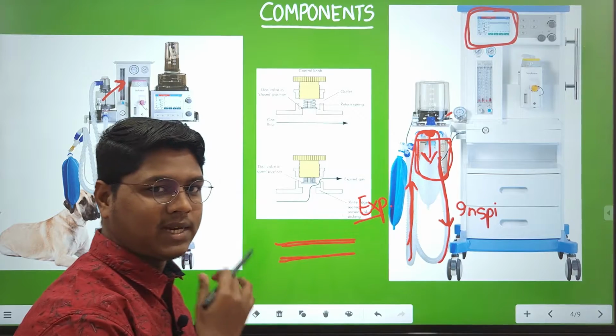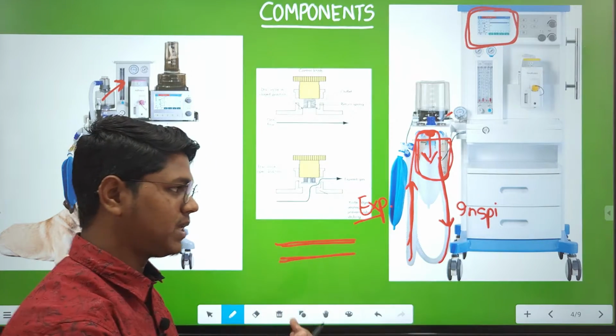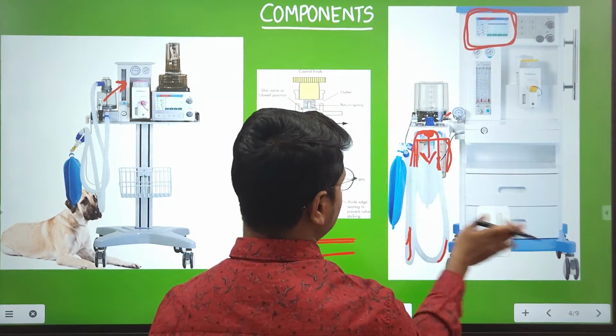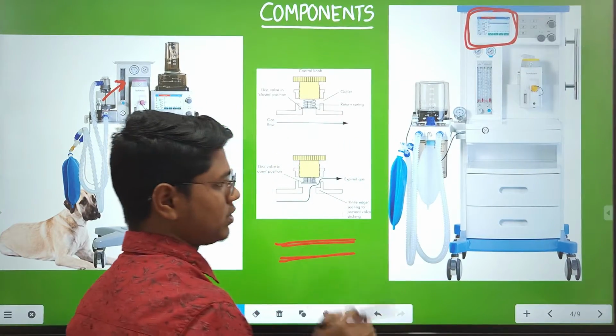From that you will know it is time to change this soda lime, so fresh soda lime will be filled in that canister. Okay, so you understood the parts.